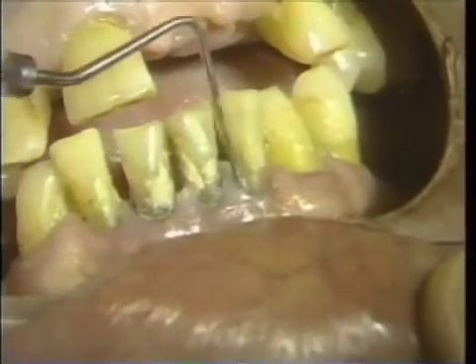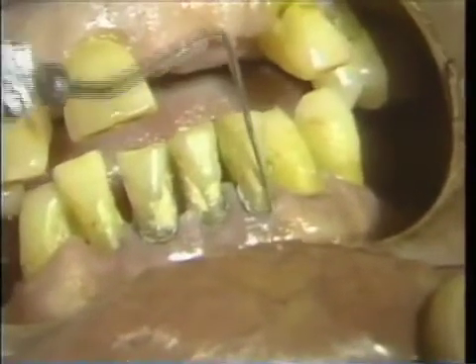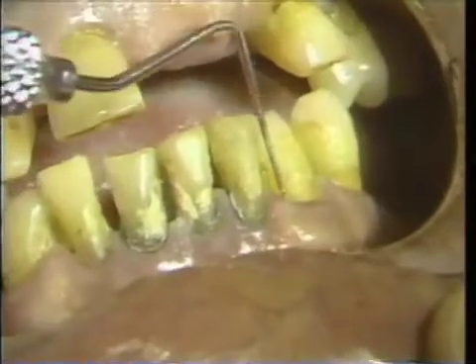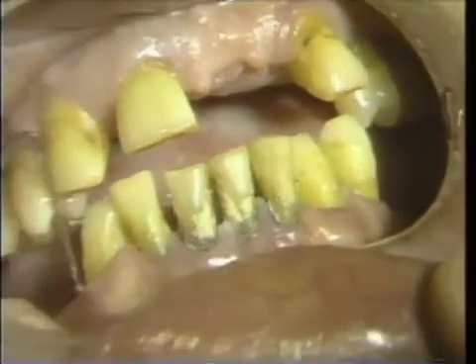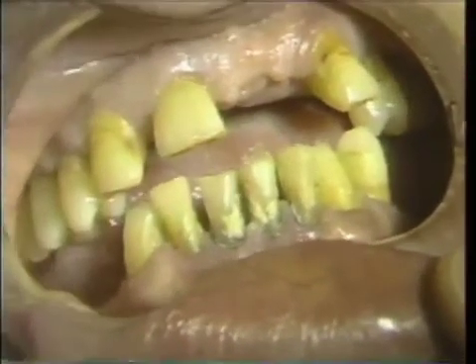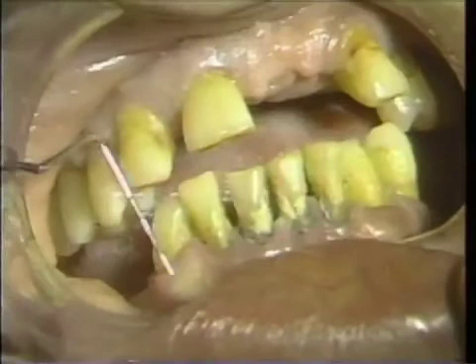The purpose of this procedure is to show the scaling and tissue reaction. This is the first visit.